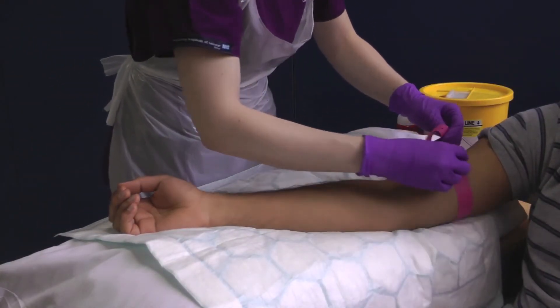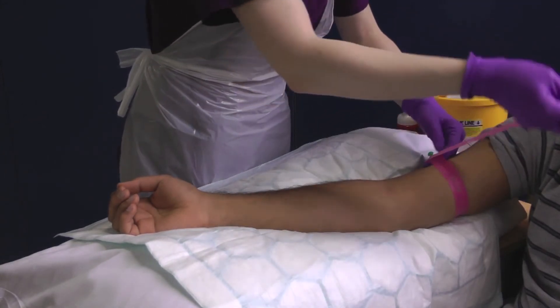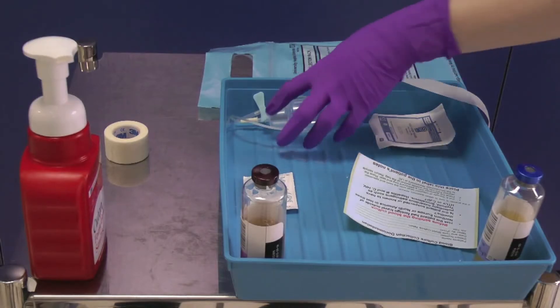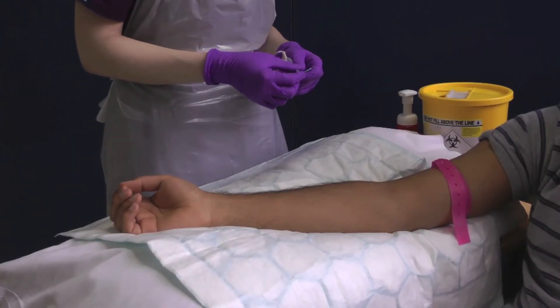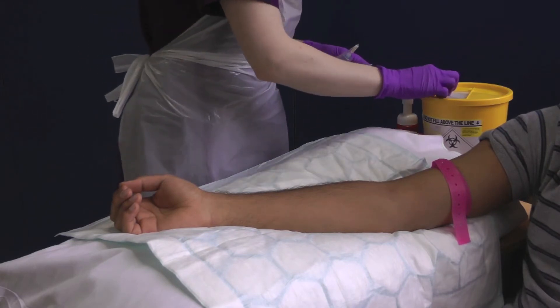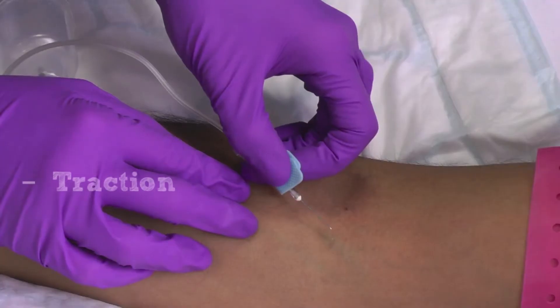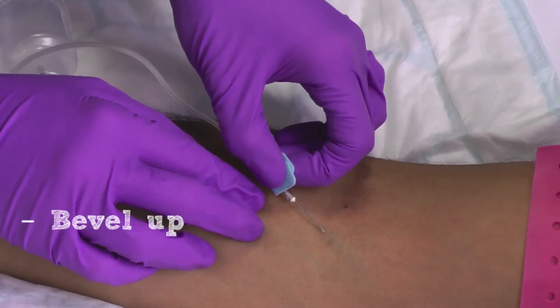Reapply your tourniquet to distend the vein. Do not repalpate the cleaned area of skin. Take your collection set and remove the plastic sheath from the winged needle. Apply traction below and to the side of the proposed puncture site to help immobilise the vein. Advance the needle bevel up into the vein.